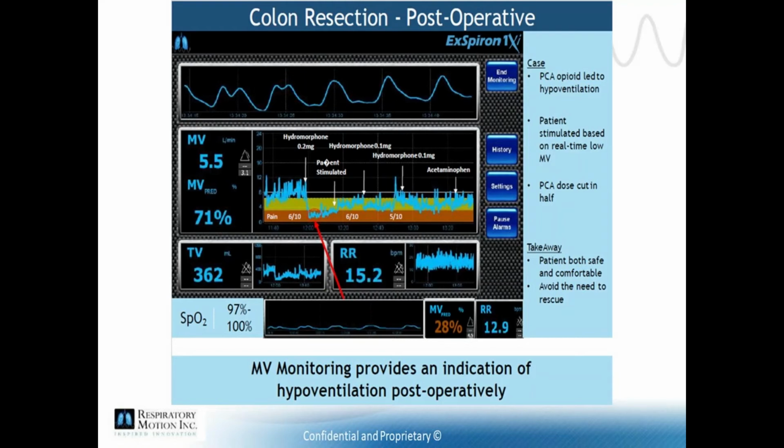Staff nurses can perform early and simple actions such as stimulation and repositioning. You can also consider adjusting the patient's medication regimen and encourage the patient to expand their lungs post-operatively, and ultimately consult with their physician team for further instruction should alarms continue.